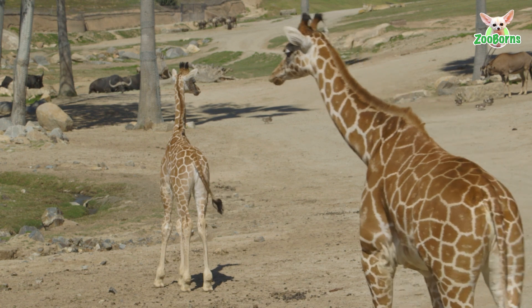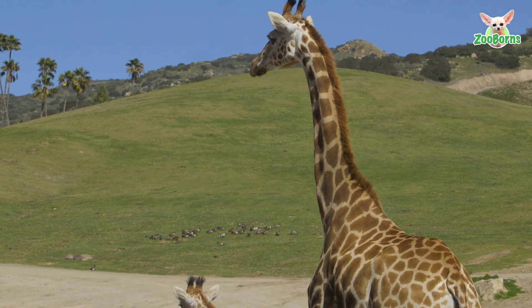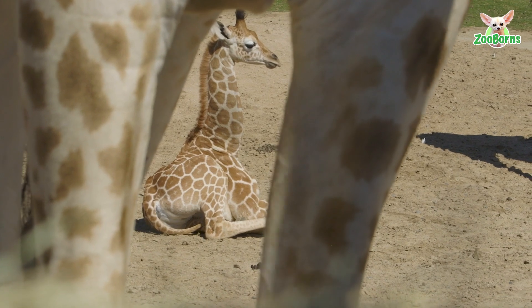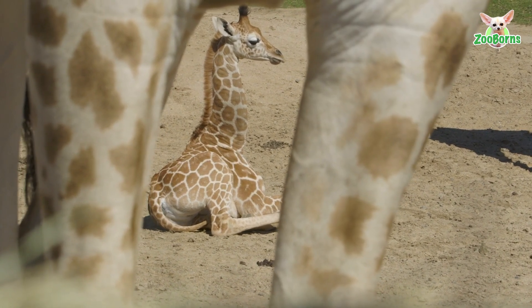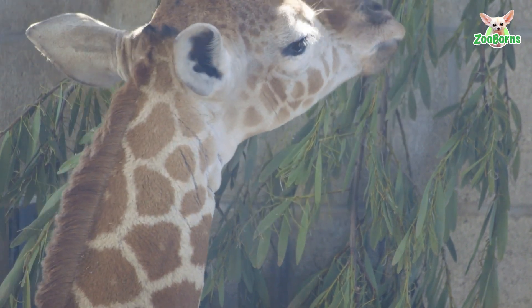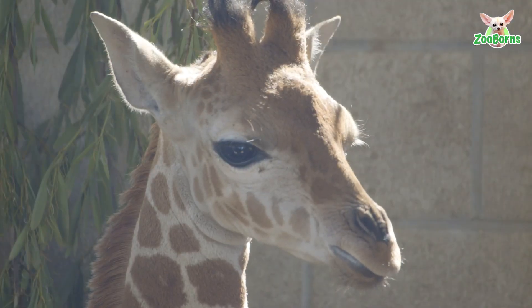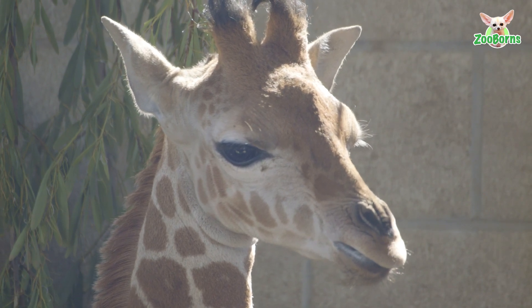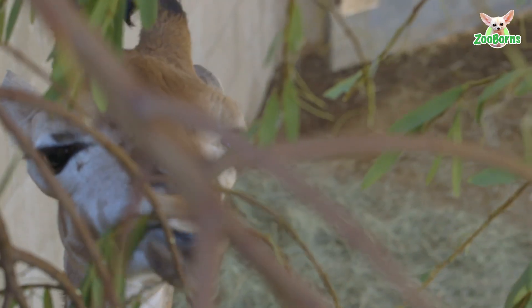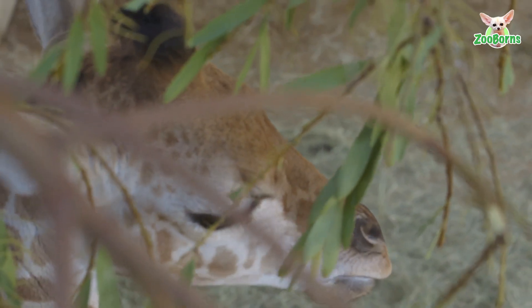The securement of the brace is essential — that's probably the biggest challenge for this giraffe. This is the third brace we've attempted. The first off-the-shelf brace had a lot of rotational instability and would slide towards her core and toward the bottom of her foot. The second brace, developed with the Hanger Group, was much more extensive and worked better, but still had some rotational instability and needed daily adjustments. The third brace, fully customized specifically for this giraffe, is a much better fit — it doesn't rotate, doesn't drift, she's comfortable, the articulation is perfect, and it provides the exact range of motion we need.